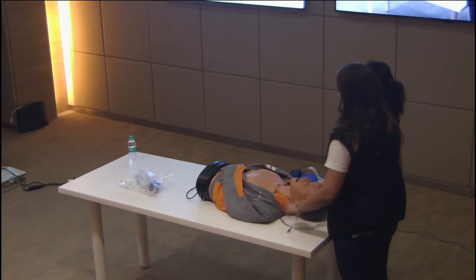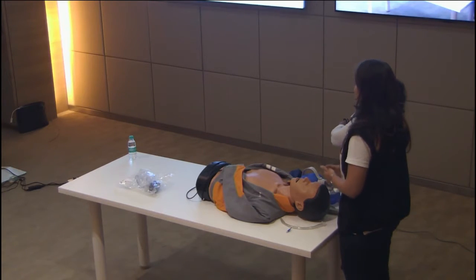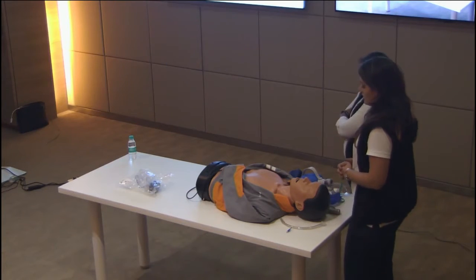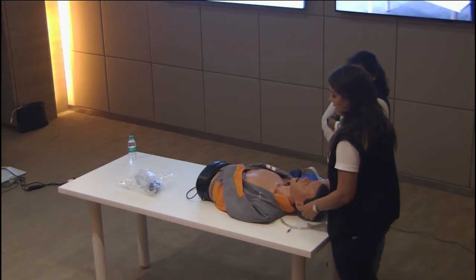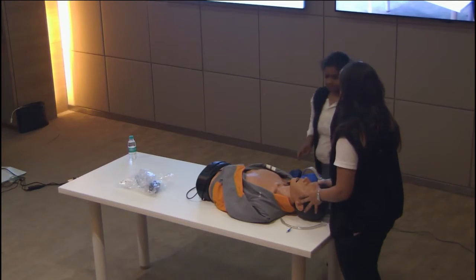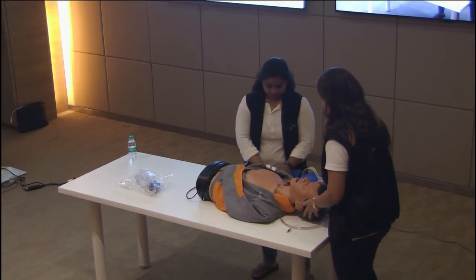Now let's take another patient who's having, say, a bowel pathology and has come for an intestinal obstruction. We're going to take something like that. And we have something called rapid sequence induction. You've heard about rapid sequence induction? It's something that you do fast. That's what rapid sequence induction is all about. So let's see, Dr. Pallavi, what is rapid sequence induction? So this second patient has come with a bowel obstruction. We are going ahead with rapid sequence intubation for this patient. Dr. Vajanti, please give him 100 milligram of propofol, 100 micrograms of fentanyl, and give scoline.